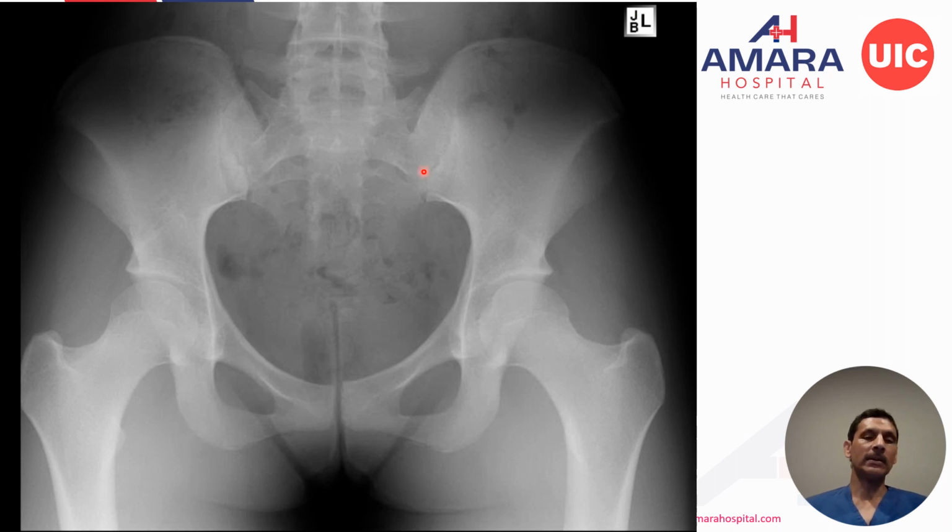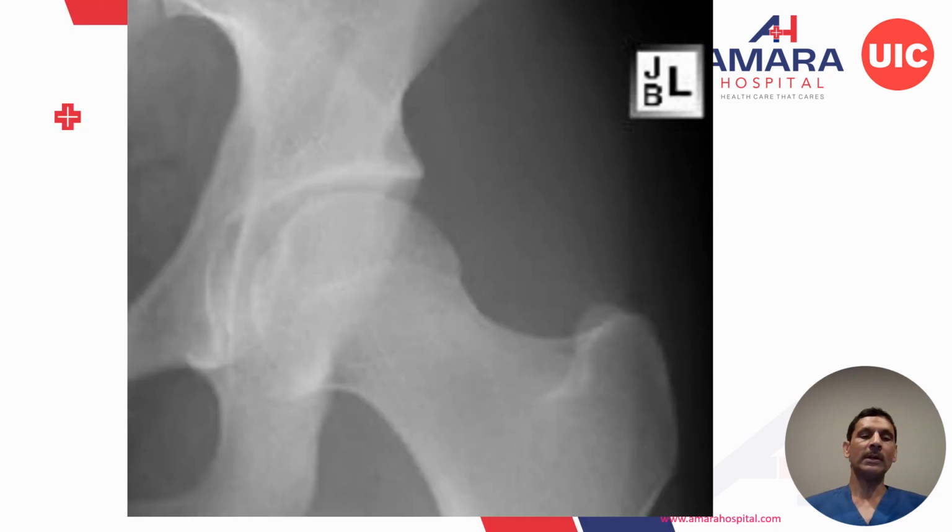So this is a good X-ray, no rotation, right? Mid-sacral line going down to the pubic symphysis. Tilt is quite adequate. The foramina are adequately seen. They're not too big like an outlet view and not too small like an inlet view. I can't tell the distance here from the coccyx to the symphysis. Maybe a little more than ideal, but well within acceptable limits. It's a good X-ray. Then we're going to focus on the left hip.